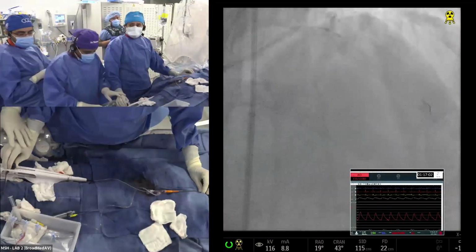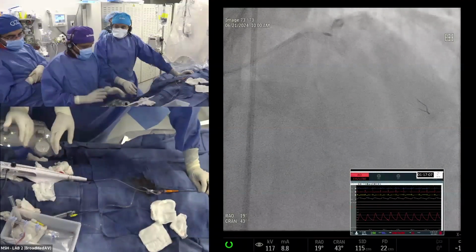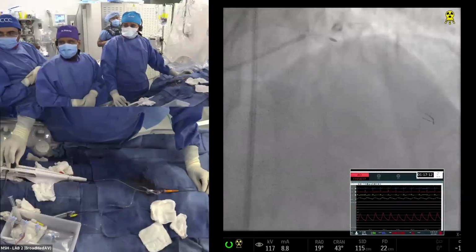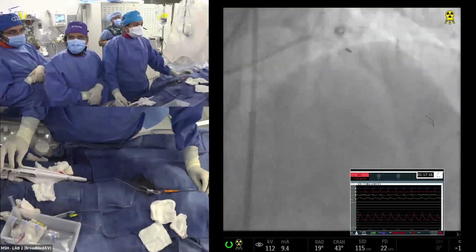Guys, one second. Turn on the dynaglide and make sure we increase the speed. Not connected. Go now, connect. Go. Don't worry, it was okay. Good. Go. Very good. Okay, same 150.